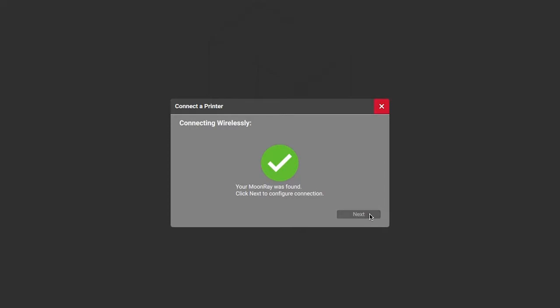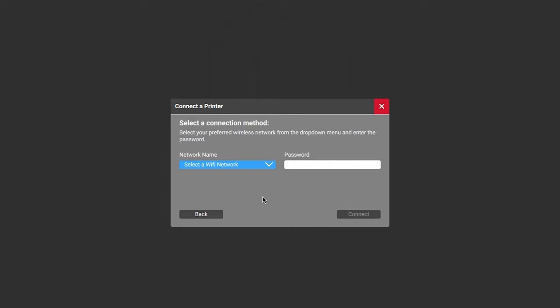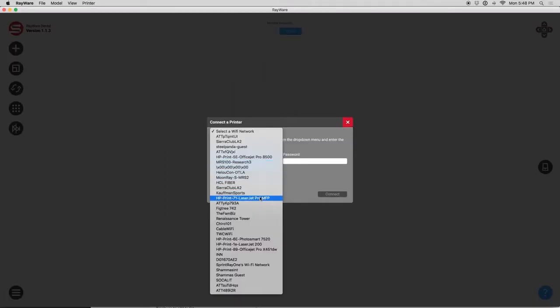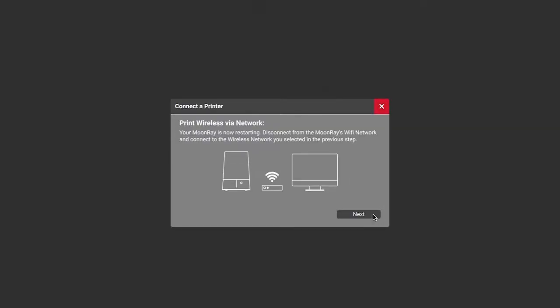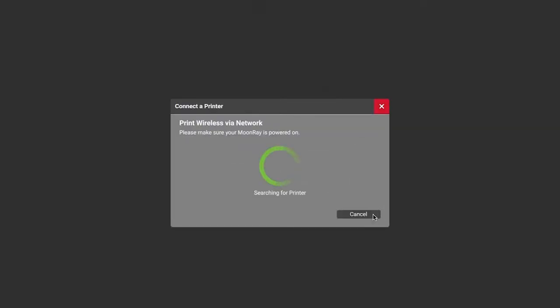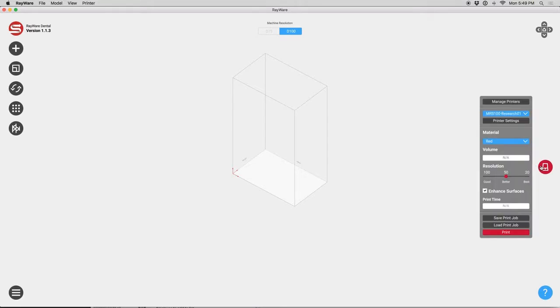Once connected, you'll have 2 choices. Connect to Network allows you to print using your wireless network, while Print Direct is an option for printing without an internet connection. Find your wireless network from the drop-down and enter the password to proceed. Reconnect to your regular wireless network while your Moonray restarts to complete the connection process. You are now connected. You can adjust your connection settings from the Moonray button by clicking Manage Printers.